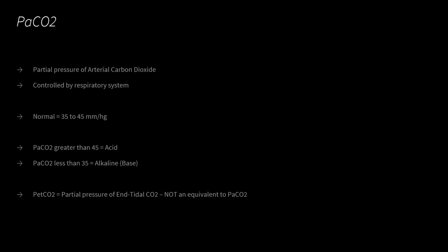And we see that when we measure CO2 in cardiac arrest, right? Our carbon dioxide levels, when we sample it through the end-tidal CO2 monitoring, is low in cardiac arrest. But if you were to do an arterial blood gas on a patient in cardiac arrest, the CO2 would often be high because the CO2 is not able to diffuse across the alveolar membrane because it's not perfusing those alveolar membranes appropriately. And so you're only getting a small portion that's actually able to diffuse across and then be exhaled to be sampled by the end-tidal CO2, right?